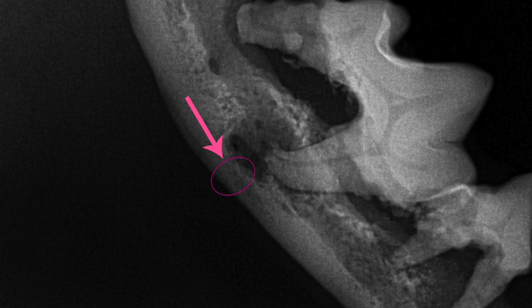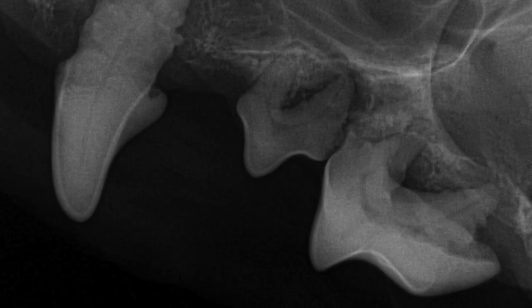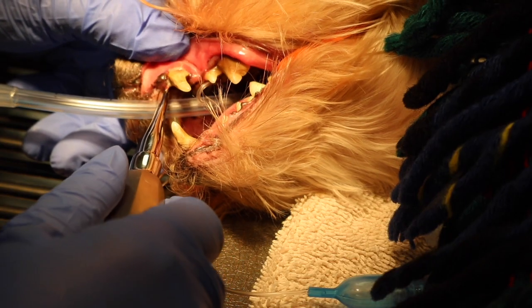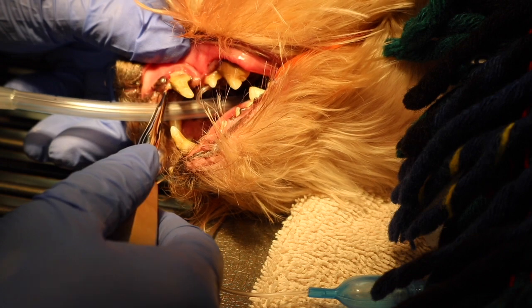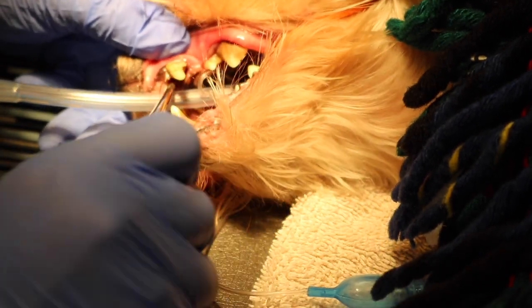This is what happens when periodontal disease goes untreated. Other than his jaw about to fracture, the rest of these x-rays are just as bad. I can't even imagine how much pain this little guy was in. So needless to say, all of this guy's teeth were pulled. He only ended up having two teeth left in his mouth that were actually viable.